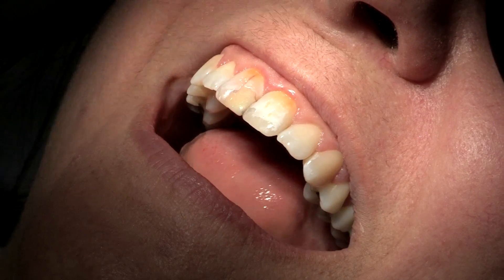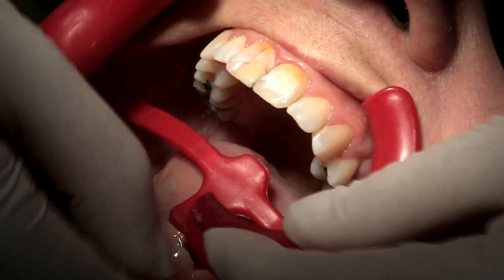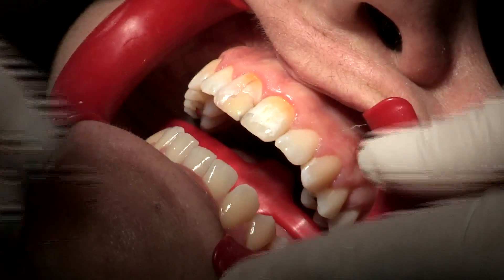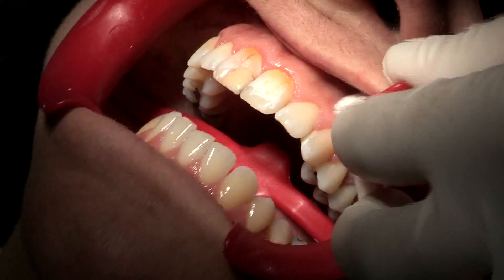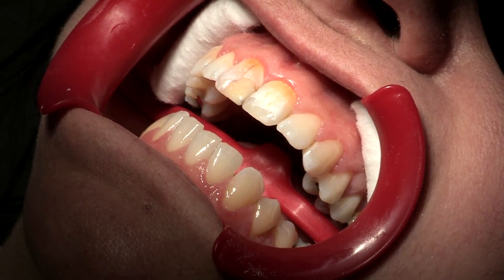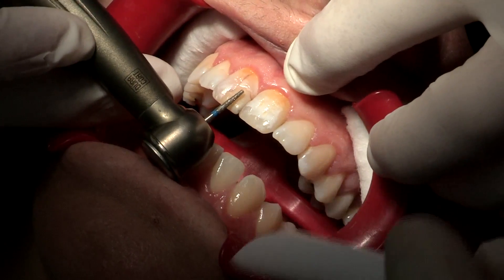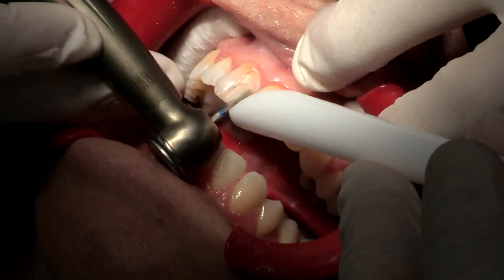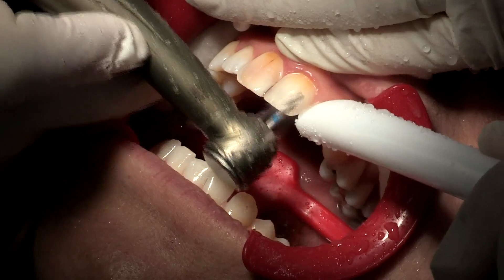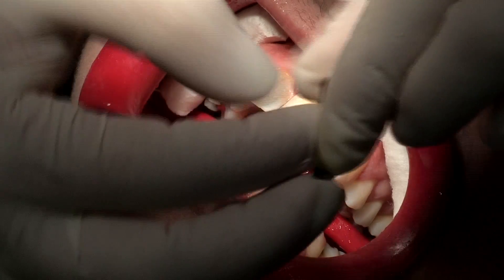First I'm going to put the retractors. After I've minimally prepped the teeth, I will put my separators.